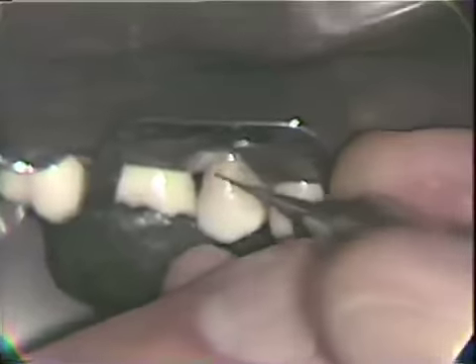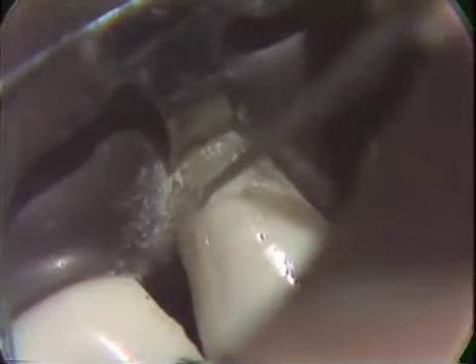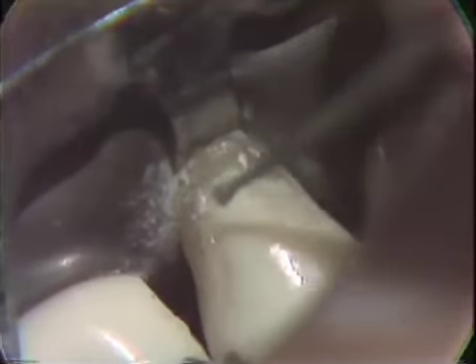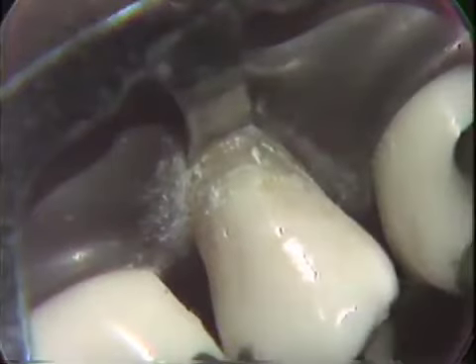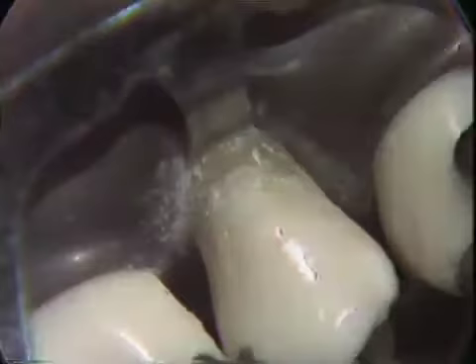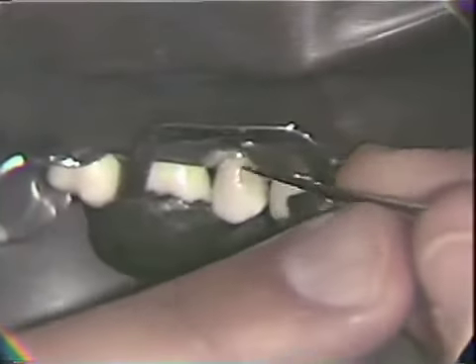Coming back to this distal wall again, just for a moment, using here again the straight hand piece as opposed to the contrangle because of the convenient access that we have and the minimal kind of tooth reduction that is necessary.